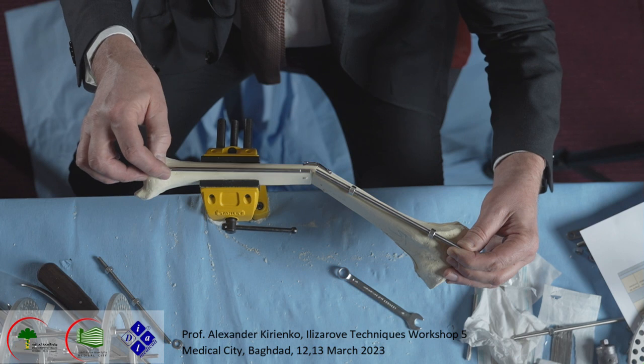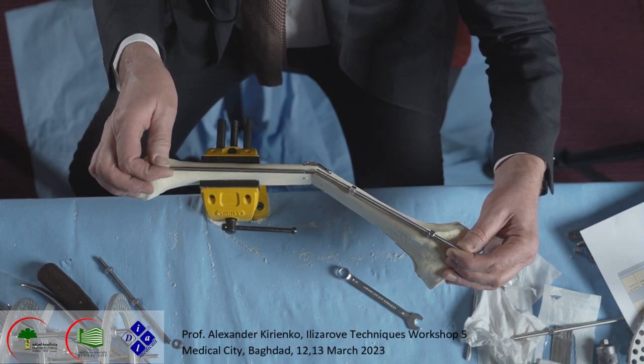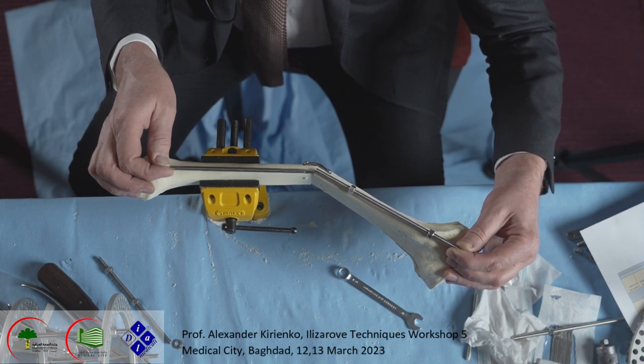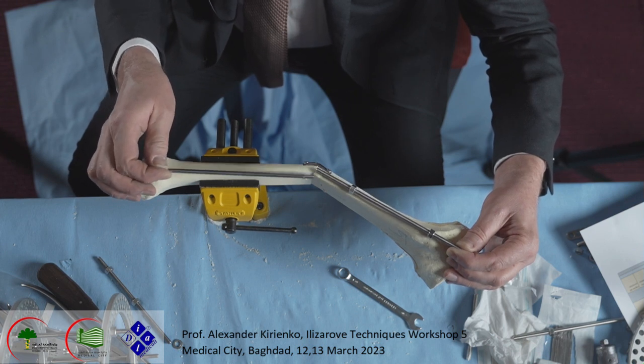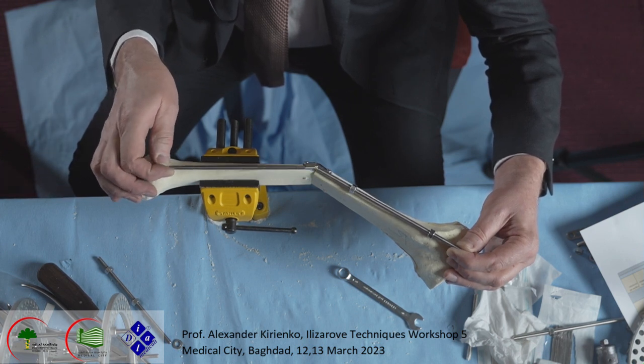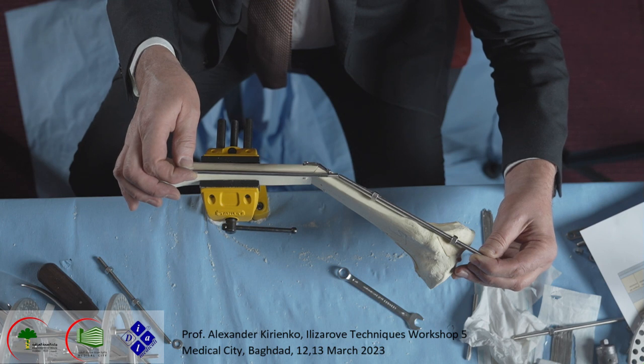And what we see, we design the anatomical axis of the proximal tibia, the anatomical axis in the distal tibia, and we realign that. Exactly at this level where we broke the bone, there is a deformity.